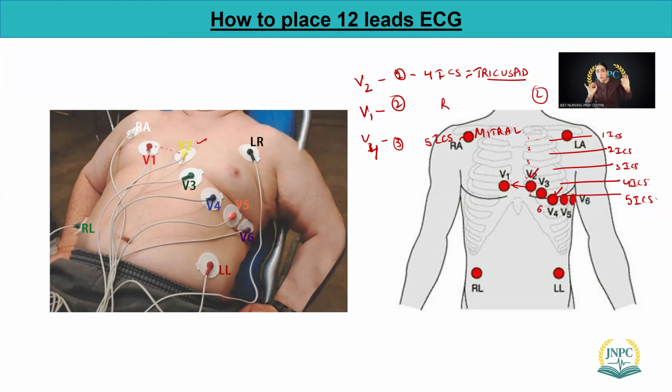So in between, I don't worry too much, wherever you feel like the center point. So then you can put that V3. So if you can see, it is coming right on the ribs, but that's okay. But you need to see, it is not going straight, right? It is following that rib pattern, how those ribs are.